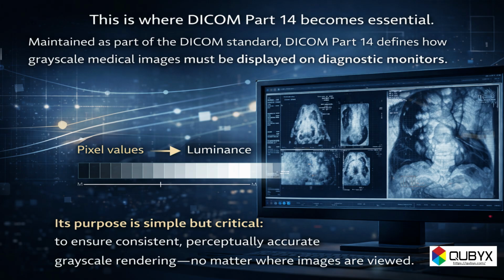This is where DICOM Part 14 becomes essential. Maintained as part of the DICOM standard, DICOM Part 14 defines how grayscale medical images must be displayed on diagnostic monitors. Its purpose is simple but critical. To ensure consistent, perceptually accurate grayscale rendering, no matter where images are viewed.